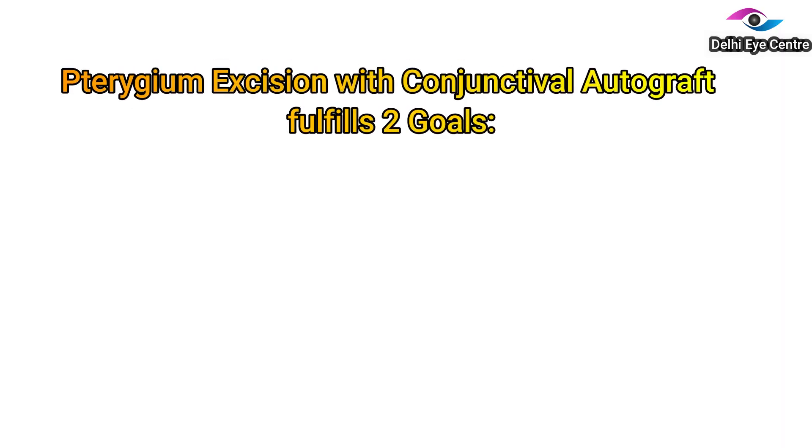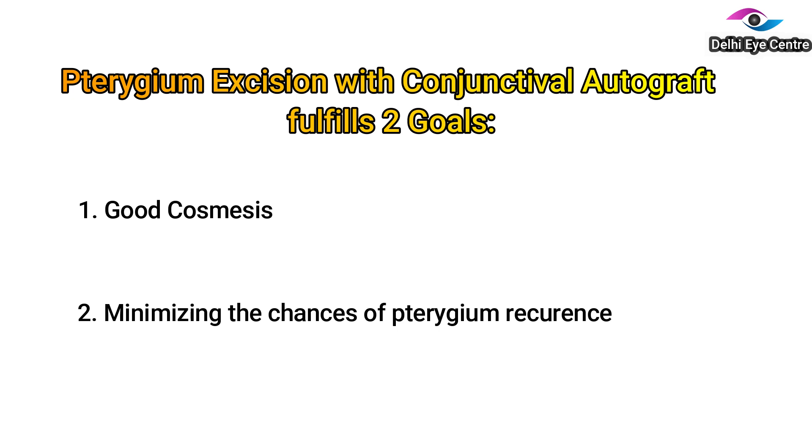This procedure of pterygium excision with conjunctival autograft fulfills two major goals of pterygium surgery: first, to obtain good cosmesis, and secondly, to minimize the chances of recurrence of pterygium.